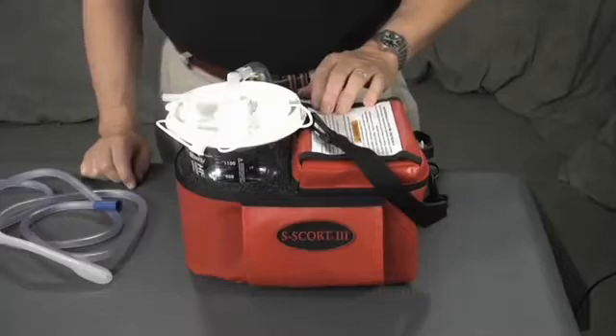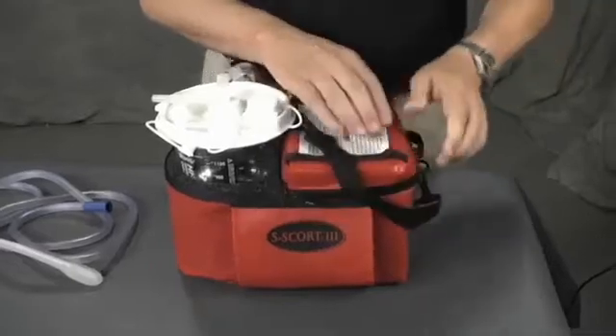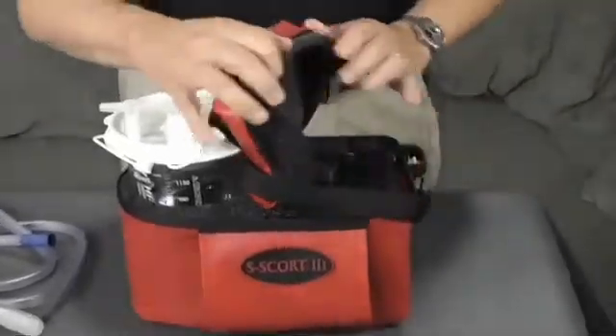Durability is important in the field. Caregivers are moving fast and often operating in tight quarters. During an emergency, equipment can take a hit. The Escort 3 is constructed with a foam core that securely holds the components and protects them from collisions with door jams and the occasional fall.